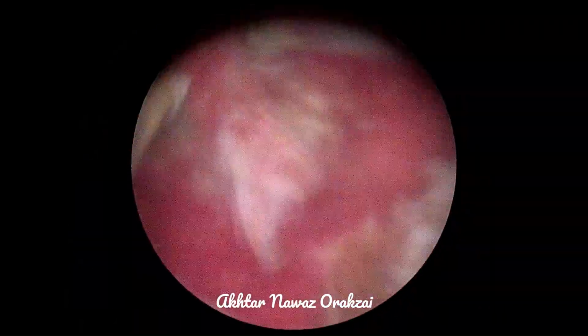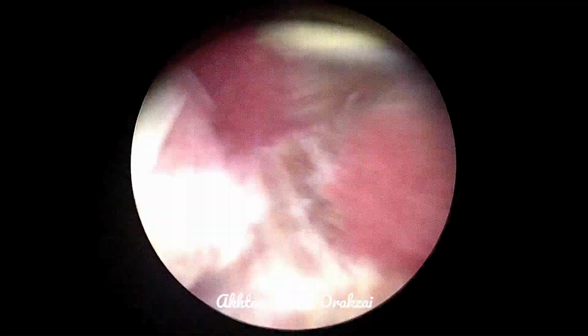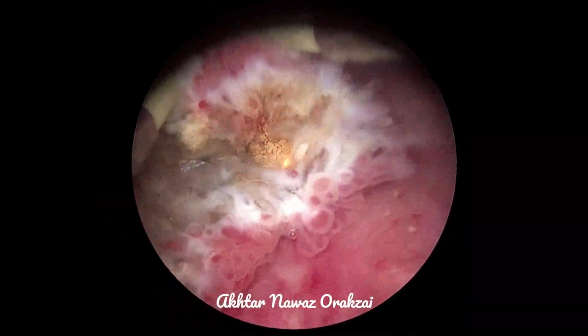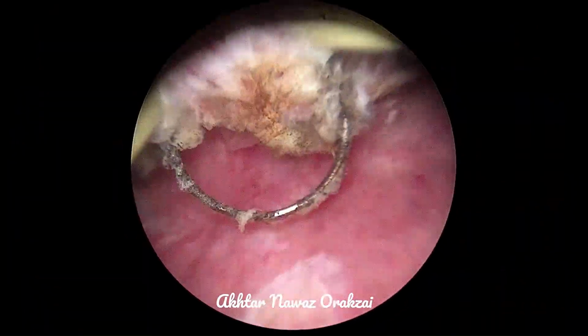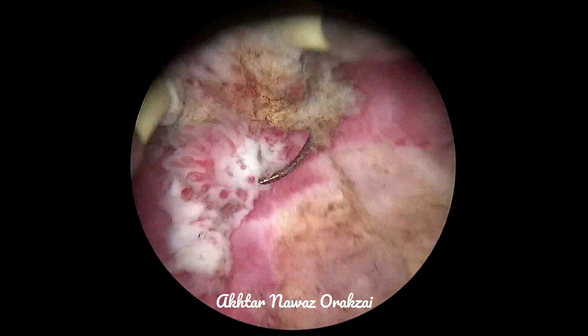Number one. Number two, care should be taken only to resect some half of the tumor towards the base, so that we know where the base is, and then resect the rest of the half of the tumor. We can go in retrograde fashion as well.